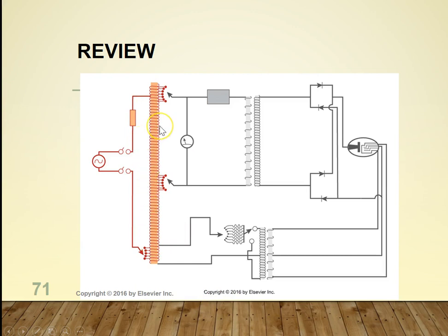Now this is that one picture again that shows the auto transformer that's here in X-ray. So this is the auto transformer, and that is the most important transformer for an X-ray circuit. And this transformer operates on the principle of self-induction, as I talked about earlier. Now, why did I go through the whole thing of mutual induction and self-induction? Know the difference between them, but the more important thing is that if you see a question, the auto transformer in an X-ray circuit works on self-induction.